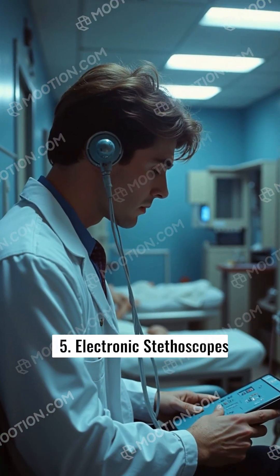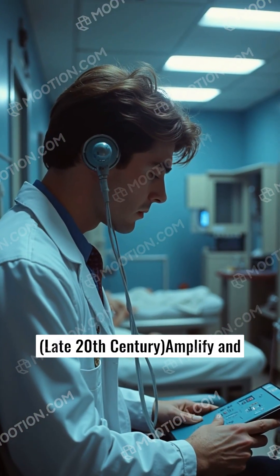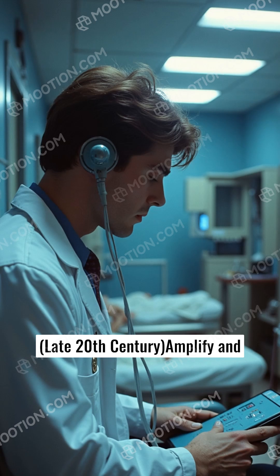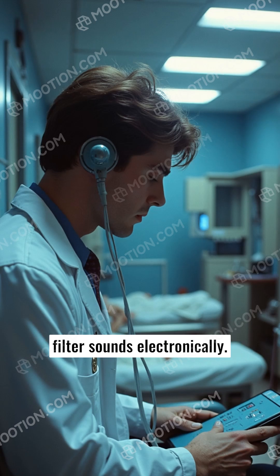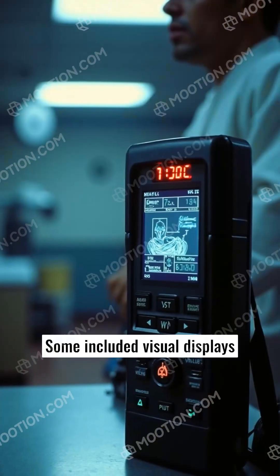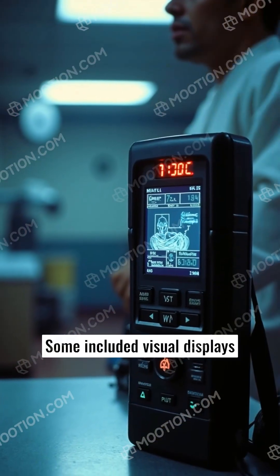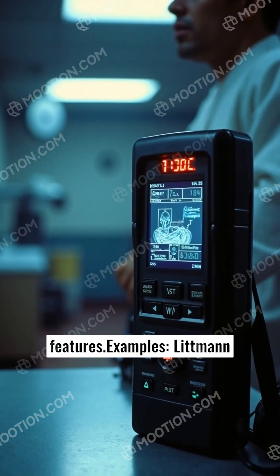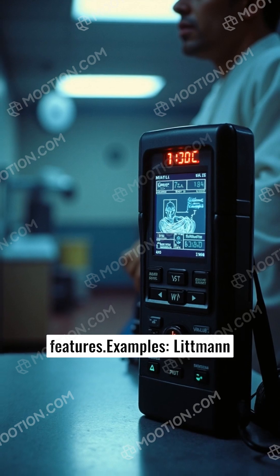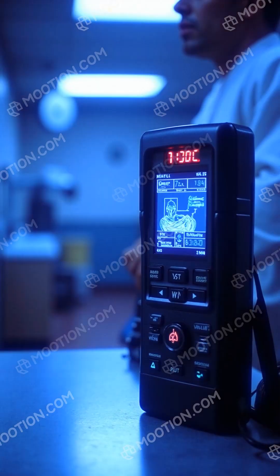Electronic stethoscopes, late 20th century. These amplify and filter sounds electronically, reducing ambient noise. Some included visual displays and recording features. Examples include Littmann electronic stethoscopes.